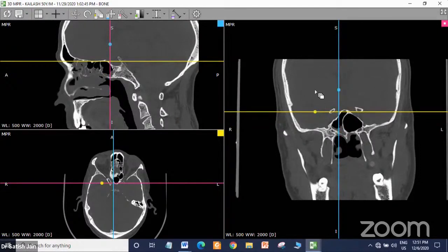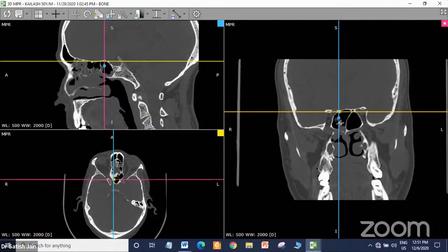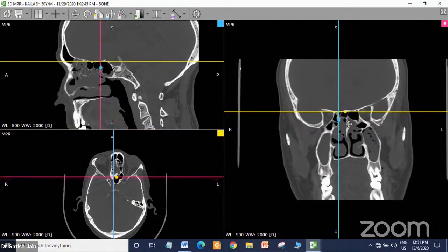You see the angiofibromas, many malignancies, and even the mucor spread to the temporal lobe right from here. So this pterygoid is a very important anatomy, not in sinus surgery, but in other surgeries. And then behind is the sphenoid sinus with minimal opacification.